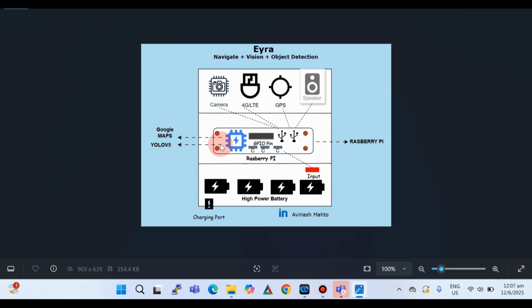I'm planning to put one sensor here. So if this person is about to hit any object, then 5 to 10 meters before, there will be a buzzer, some alarm will trigger. This is my next phase of work, which I will let you know about later. And then there is a speaker which helps convert all these communications into speech, text to speech.